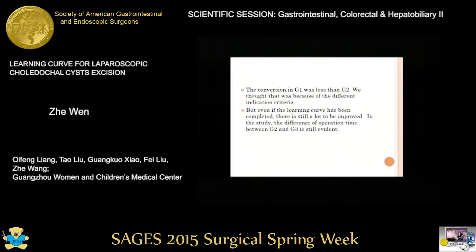But even when the learning curve has been completed, there is a lot to be improved. In our study, the difference of the operation time between group 2 and group 3 is still evident.